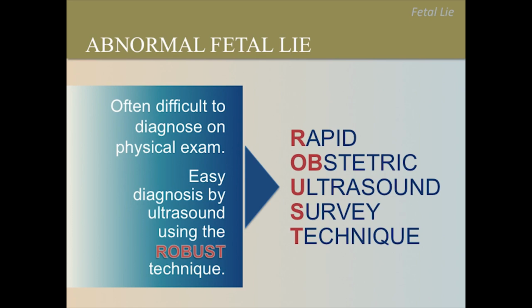We described the robust scan in an earlier lesson. Who can describe how to do a complete robust scan? Please pause the video now to ask a participant to describe the robust scan.